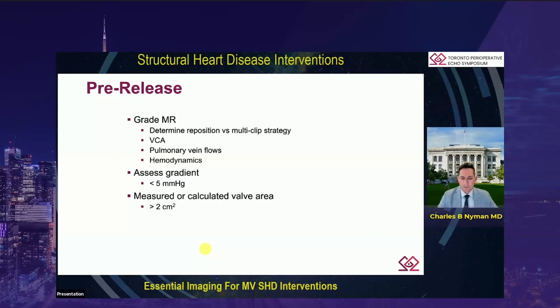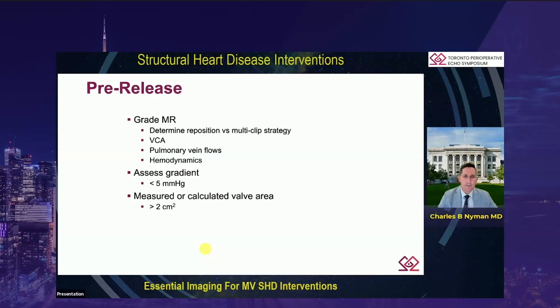Look at the pulmonary vein flows — it's lovely when you see normalization. And as an anesthesiologist, look at the hemodynamics: if you see a big jump in blood pressure, you know your forward cardiac output has gone up. Once we've assessed the MR, we need to assess the gradient. Ideally a good ballpark target is a gradient of less than 5. I will always go the route of measuring or calculating the valve area if my gradients are around 5 or greater.